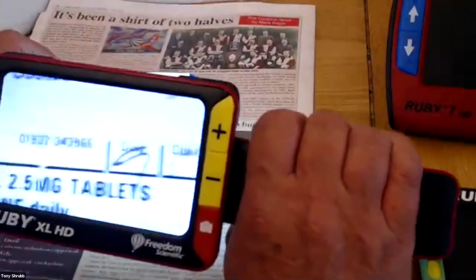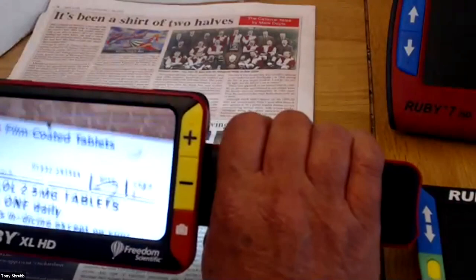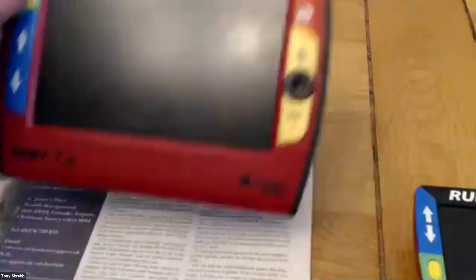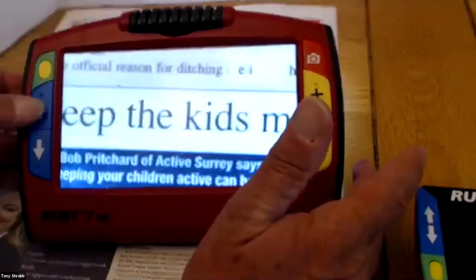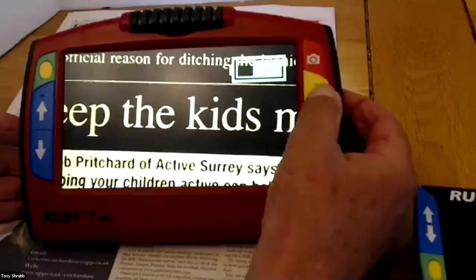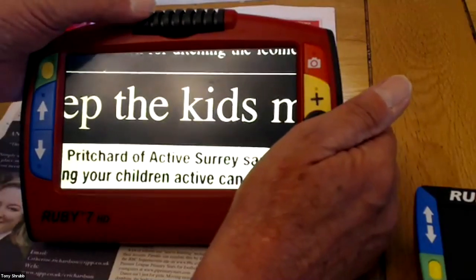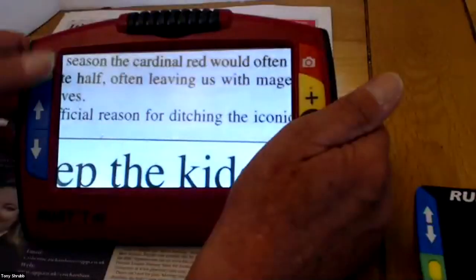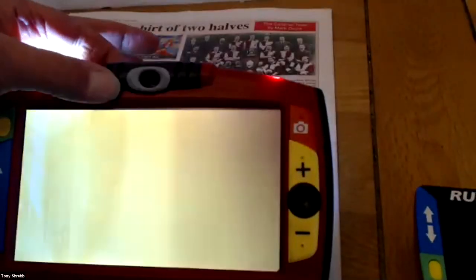We can switch back to full colour and use it to read medication labels — that answers another of Katherine's issues. Moving on, we have the seven-inch Ruby 7. It also has a 45-degree reading angle, colour changes, magnification, and the ability to freeze the image. With the pivot cam, we can swivel that camera around to different positions — including forward-facing, so you can use it as a mirror to put on your make-up in the morning.